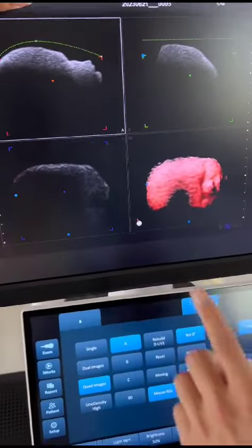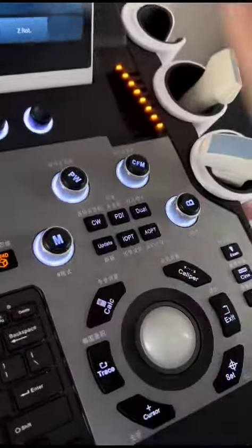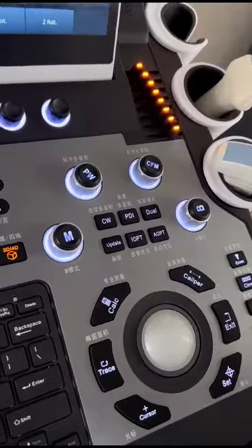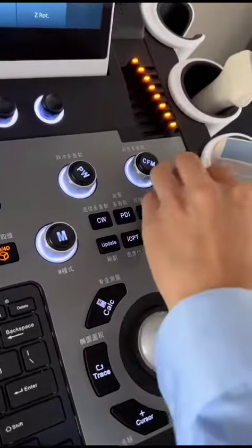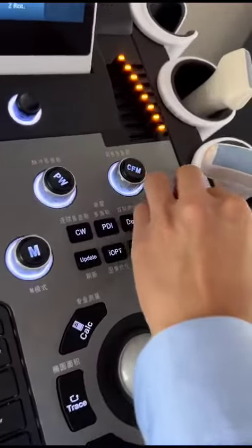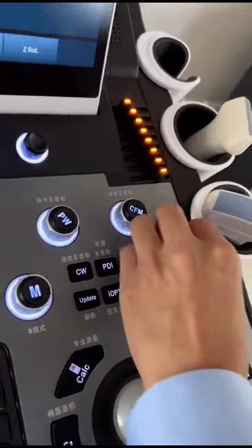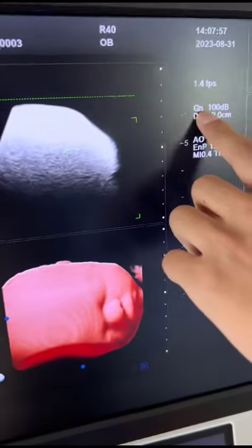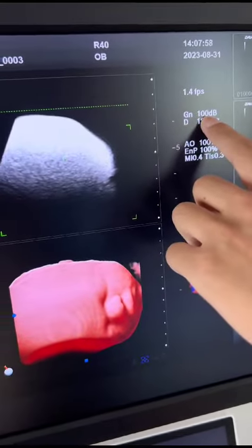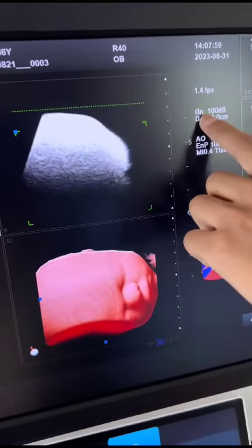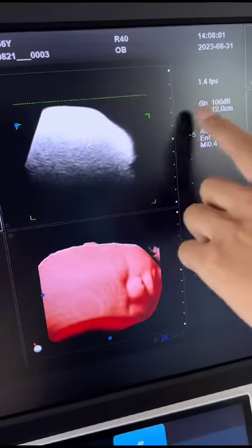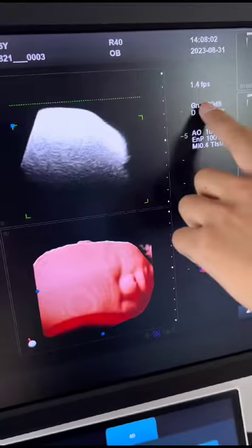Now rotate the B button to adjust the gain value to 100 or 990. It is according to your requirements.